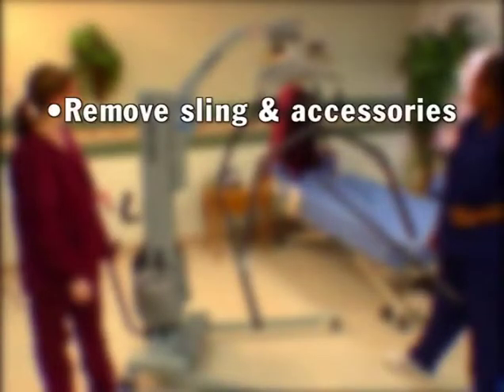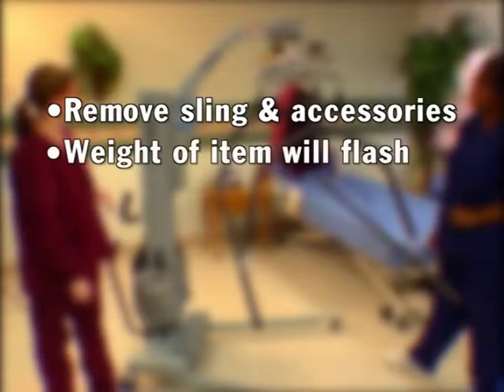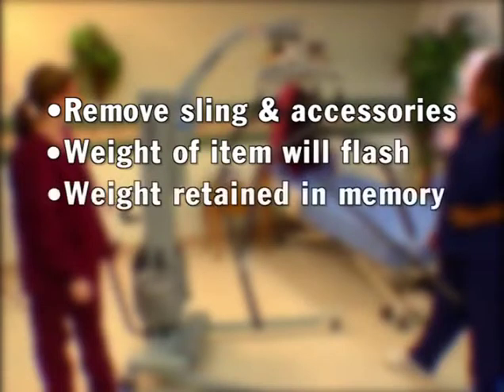Remove the sling and accessories from the hanger bar and view the scale readout. The weight of the items will flash and will be subtracted once the resident is weighed. This weight reading will be retained in memory, even if the scale shuts down on its own.